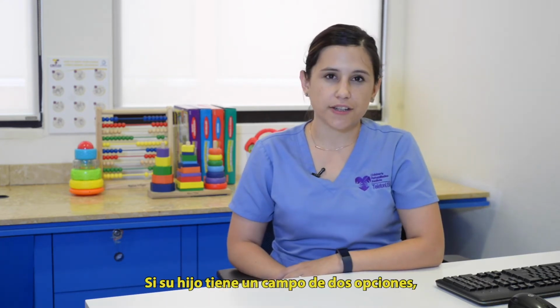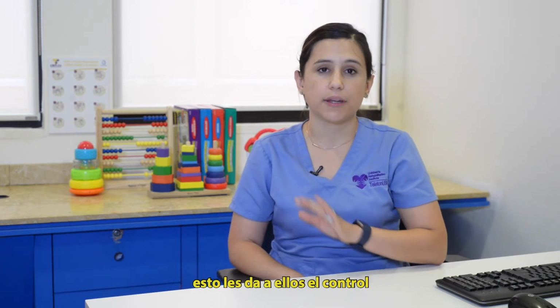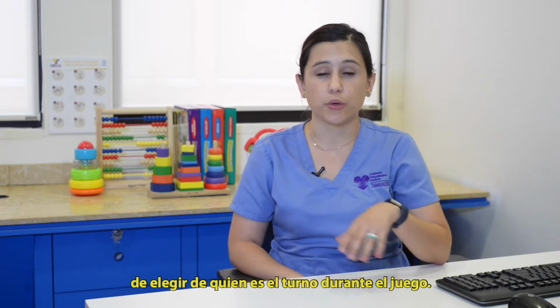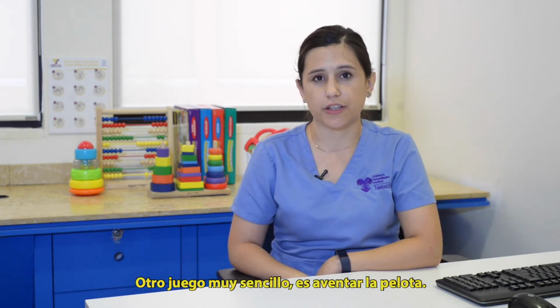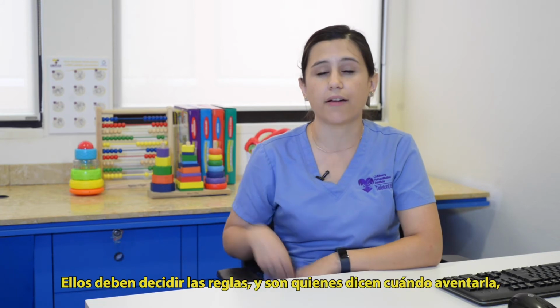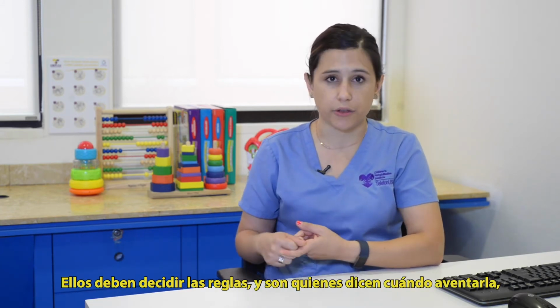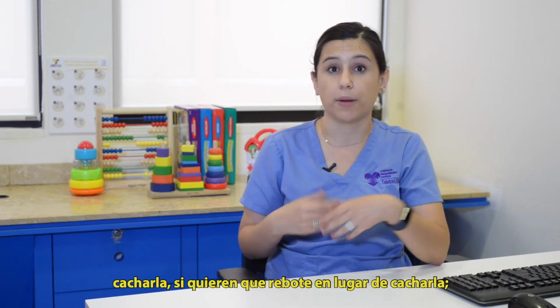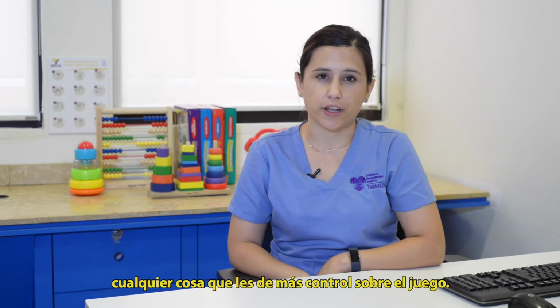If your child has a field of two options, another good thing to start with is my turn and your turn. This gives them the control to dictate whose turn it is during a game. Another easy game to play with your child is just throwing the ball. Have them be the one to dictate the rules. So they're the ones that say when to throw it, when to catch it, if they want to bounce versus throw, anything to give them more control over the game.